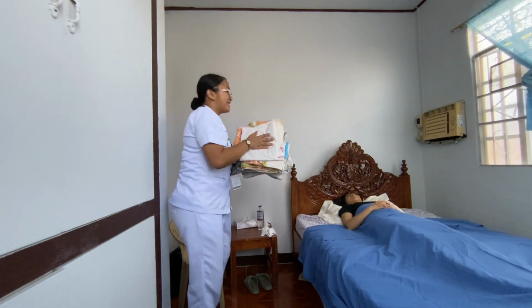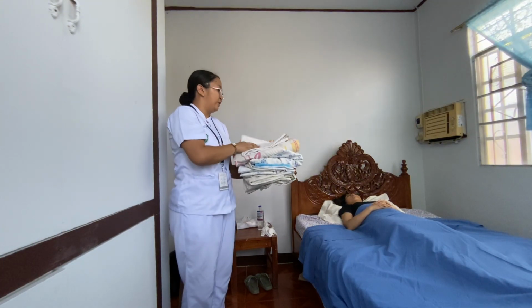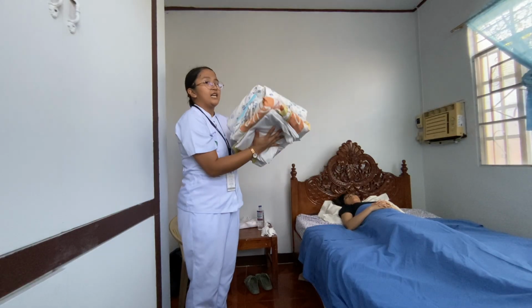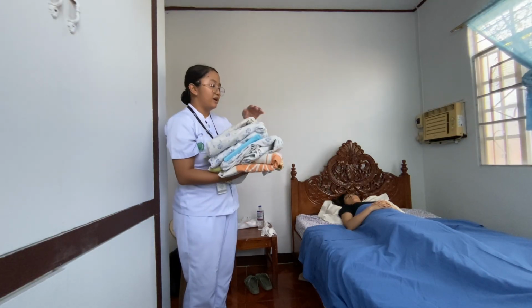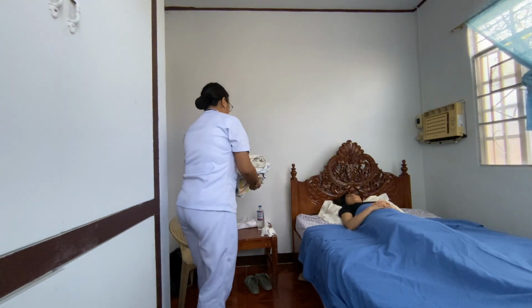Bedside table. So since ito po yung pillow sheet, nasa baba po dapat siya since siya yung pinaka-last po na ilalagay po. Ang pinaka-taas po yung pinaka-nasa ilalim po, or yung magko-cover po din sa bedsheet ni client po, or sa bed ni client.